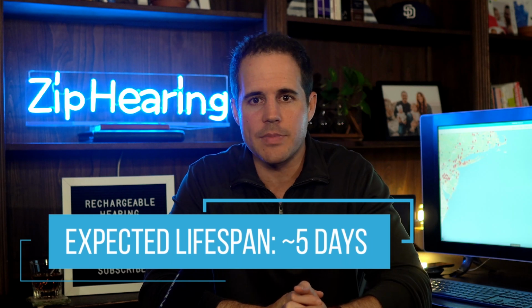Okay, for disposable models, in almost all cases, if you get a disposable model, you're probably going to use a size 312 battery. And depending on how many hours a day you wear your hearing aids, how much, if any, Bluetooth or TV streaming you do, how bad your hearing loss is, and what hearing aids you get, you're probably going to have to change these batteries every 2 to 10 days. I would say the average is probably 5 days. Plan on that to be safe.